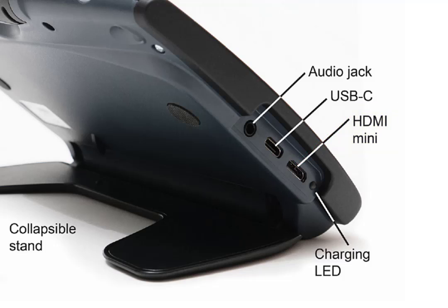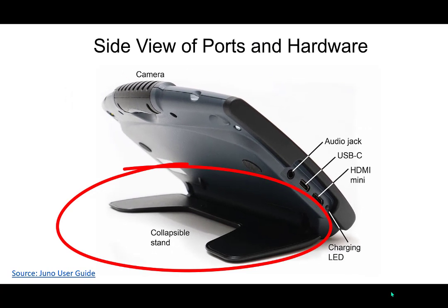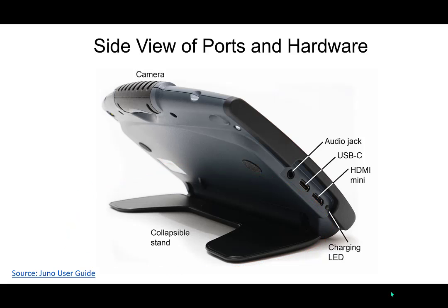The final thing on the bottom is not a port, but it's important to know what it is because you can feel it pretty well. It's the charging light, the LED. It lets you know when the unit is being charged or when it's on for those who have vision to see it. Of note also is at the back of the unit, there's this stand that pulls completely out for the unit to position the unit and to have it stand on its own.